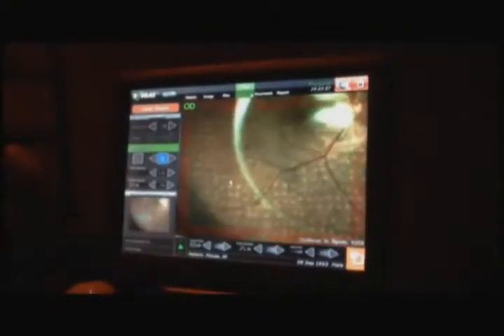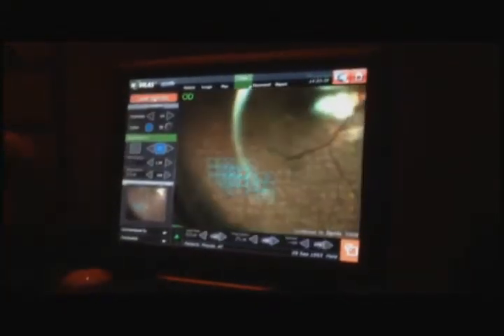We can always check the intensity of retinal burn and can adjust that along with laser parameters, such as spot size and spacing. At the end of the treatment, we can evaluate saved images, and the system will provide us with a detailed report with notification of laser energy, number of spots used, and placing.